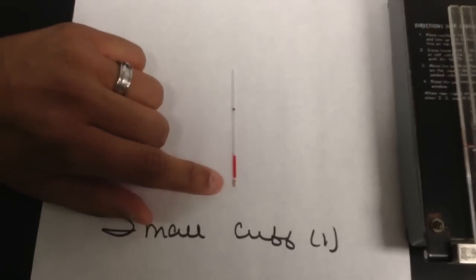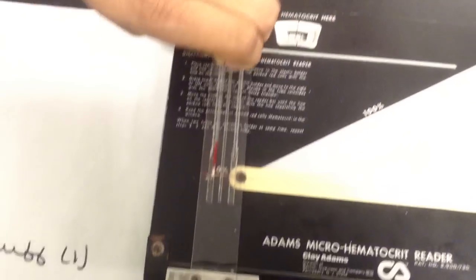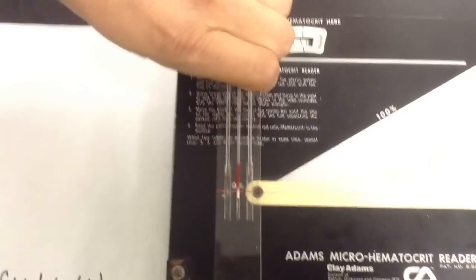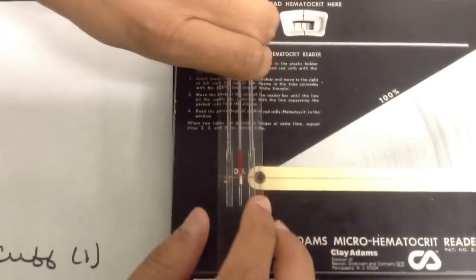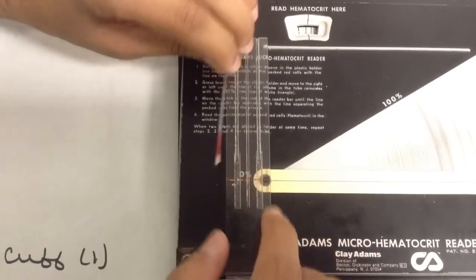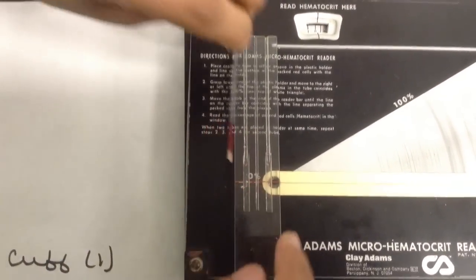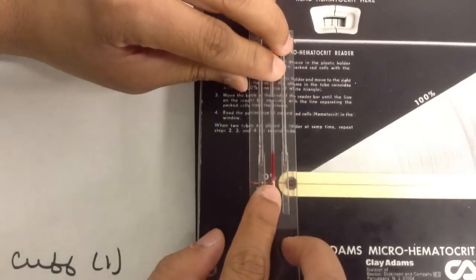So to read this, you put this here and you measure with the red line. You see the red line right there. You put this part, the red line, and you match the red line and you align it.